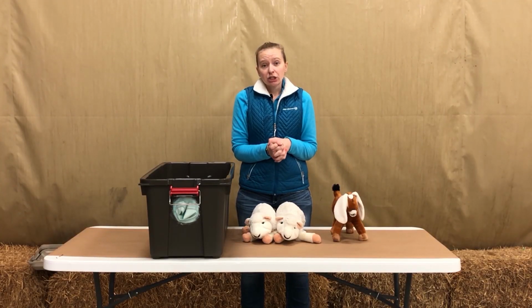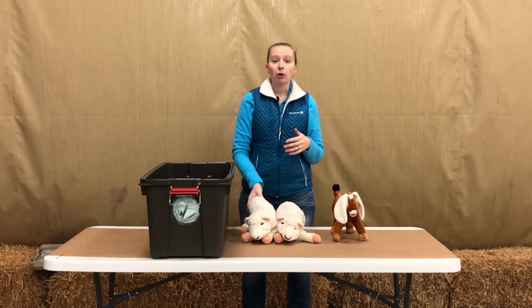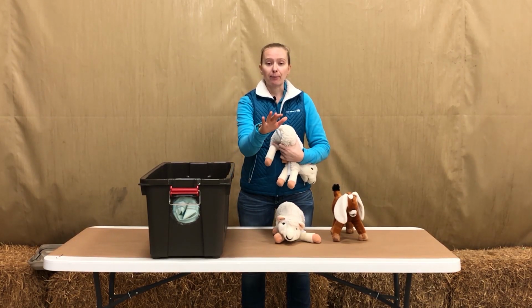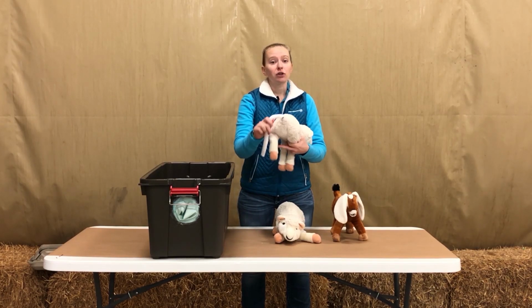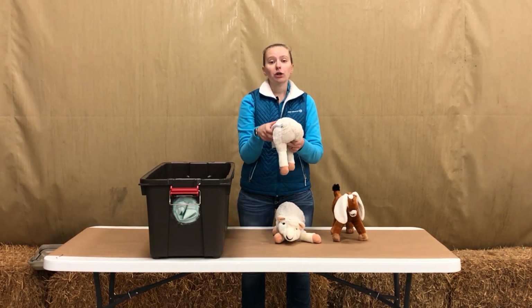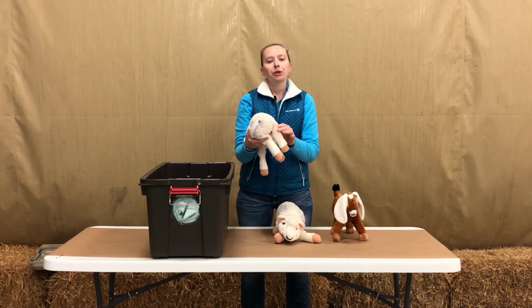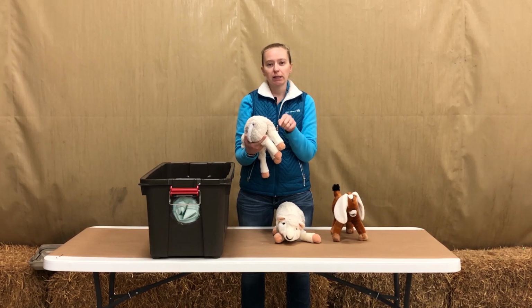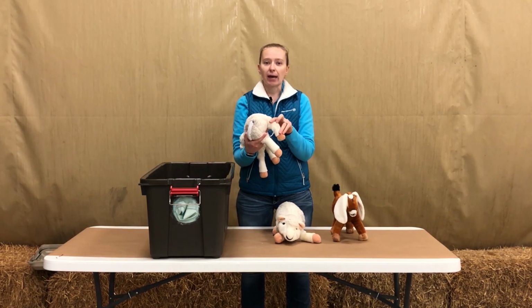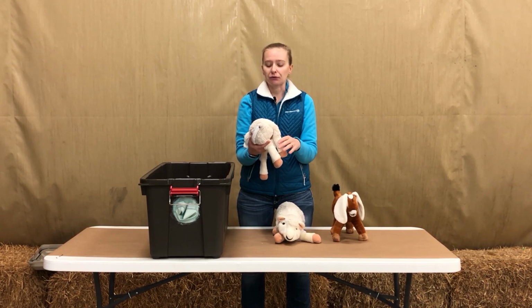The next presentation that we're going to talk about is breech. So when we talk about breech, there could be multiple different presentations that are happening. So you could have nothing at all, you could have just the tail, or you could have 1 leg or 2 legs that are the back legs. When you're feeling for the back legs, you're actually going to be feeling for that hock, that pointy elbow type that's on the back leg versus the front leg. That's how you're going to be able to distinguish the two when you're feeling.